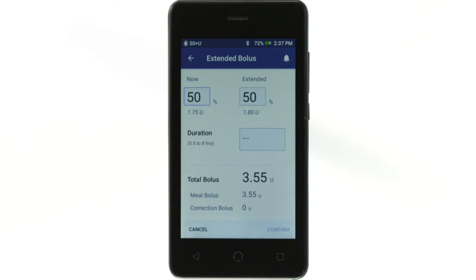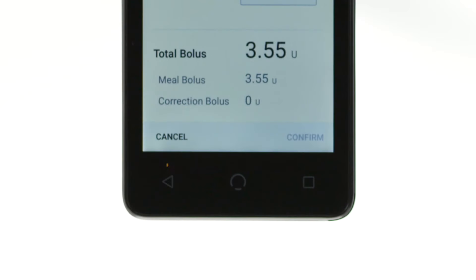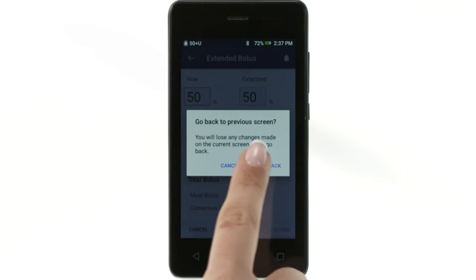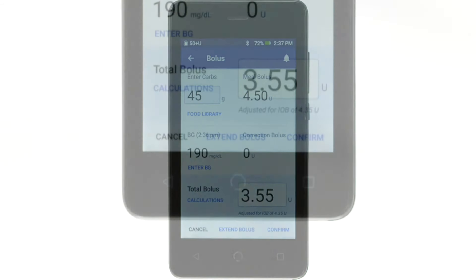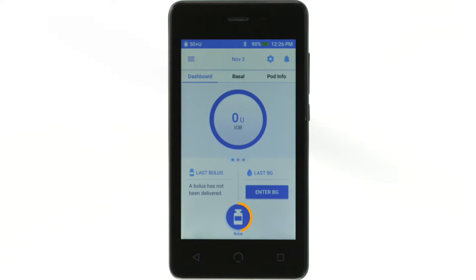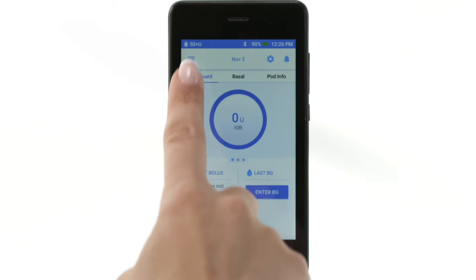Both the on-screen back buttons, as well as the triangle button beneath the PDM screen, can be used to navigate to the previous screen. The circle and square buttons beneath the screen have no function. Accessible from any home screen is the bolus button at the bottom of the screen. To access more settings, tap the menu icon on the upper left side of the screen.